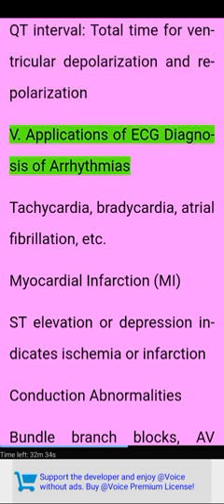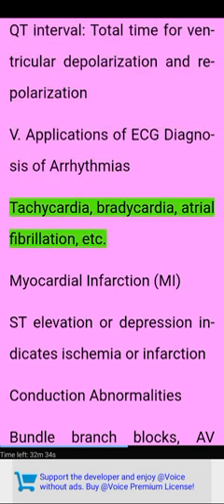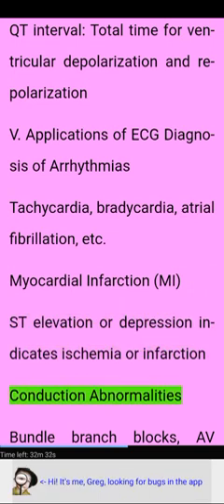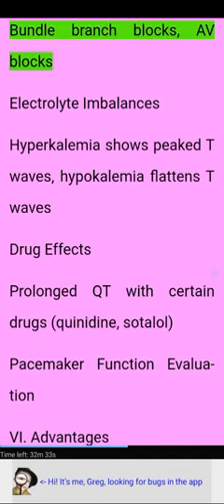5. Applications of ECG. Diagnosis of arrhythmias: tachycardia, bradycardia, atrial fibrillation, etc. Myocardial infarction, MI: ST elevation or depression indicates ischemia or infarction. Conduction abnormalities: bundle branch blocks, AV blocks.